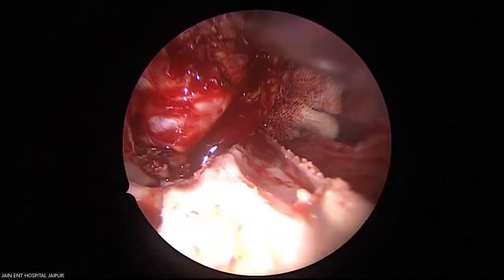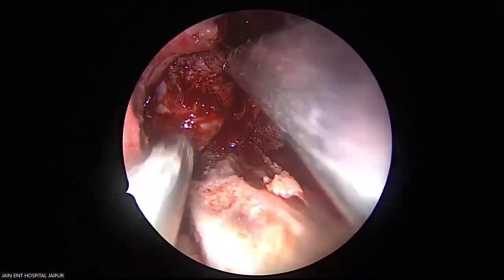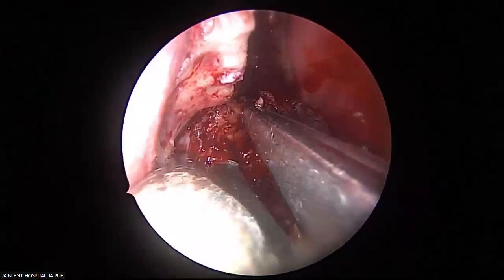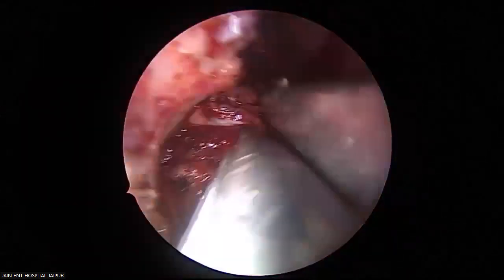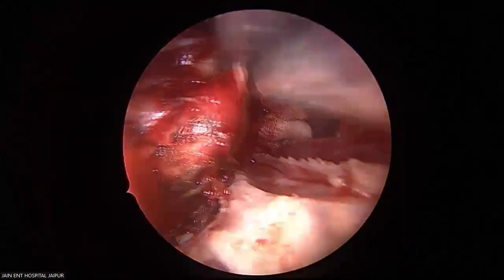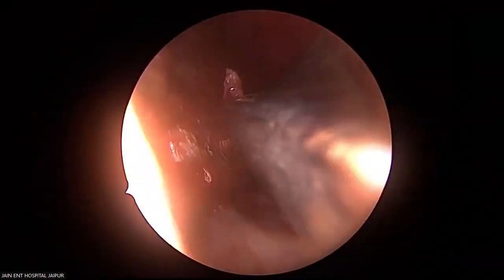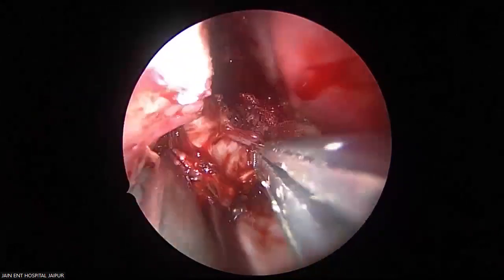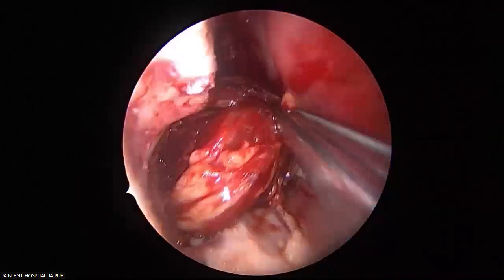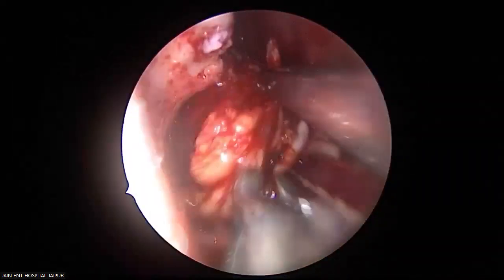Very beautifully, very clearly, the tumor. So one by one, we are advancing our instruments to pull it. See this tumor which is being pulled. Now see, such a big tumor being pulled. See this surface. Oh, what a massive one.